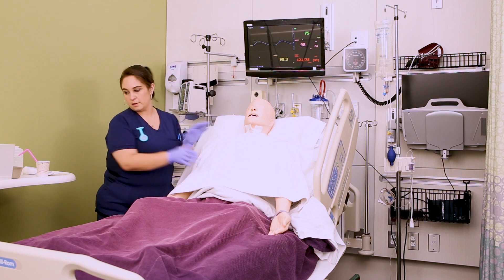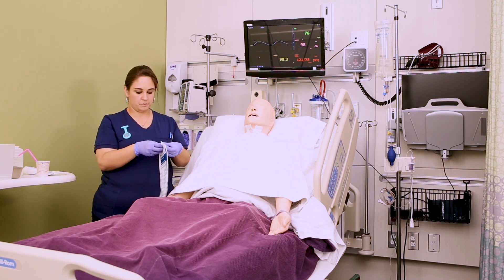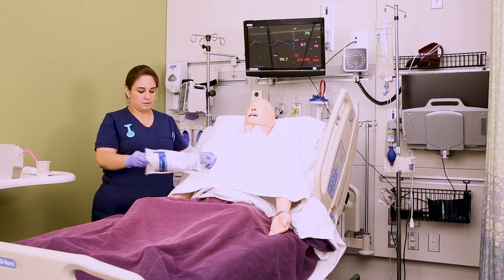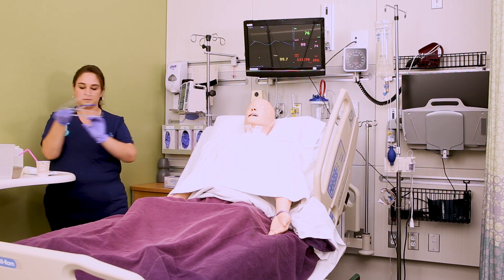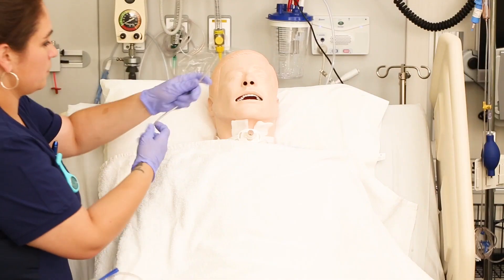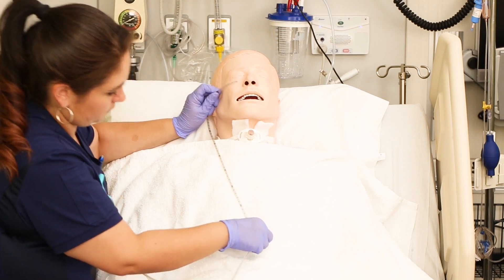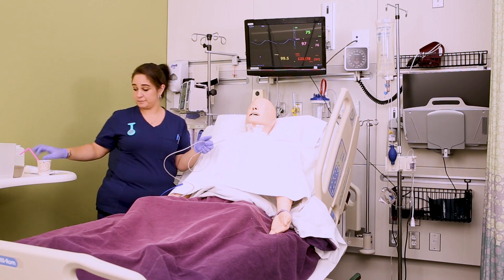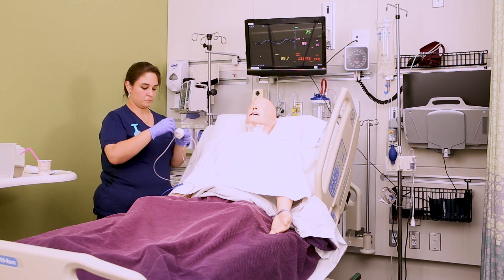Now you want to grab your NG tube package and take it out so that you can measure the length needed for insertion. In this case, we are using one of the harder plastic Salem sumps, but you might have a softer one. You're going to measure from the tip of the nose to the earlobe and down to the xiphoid process.